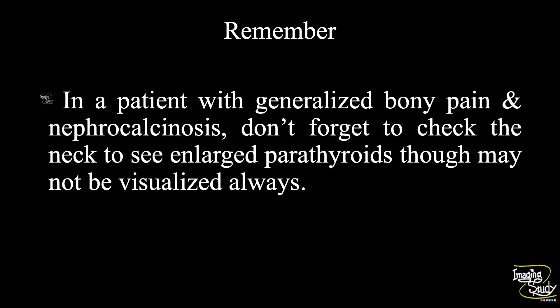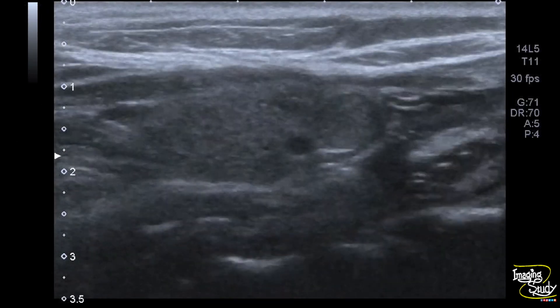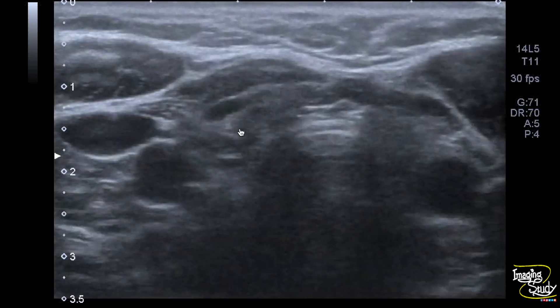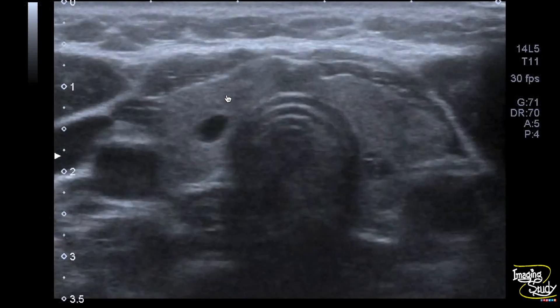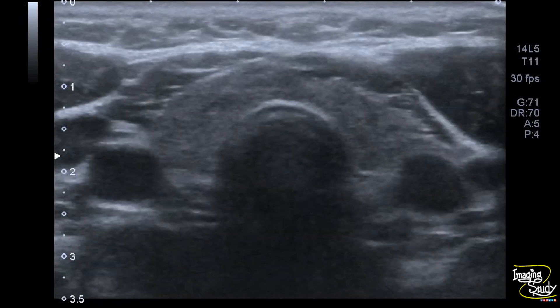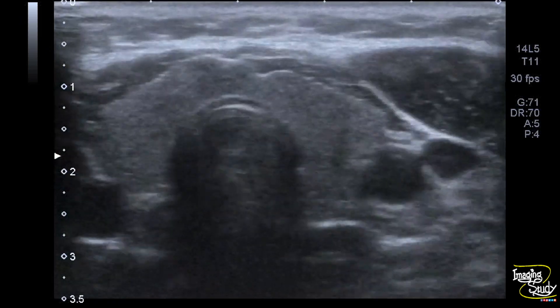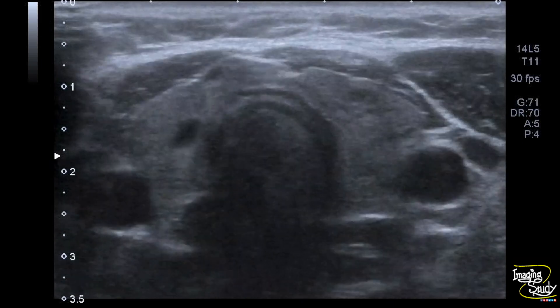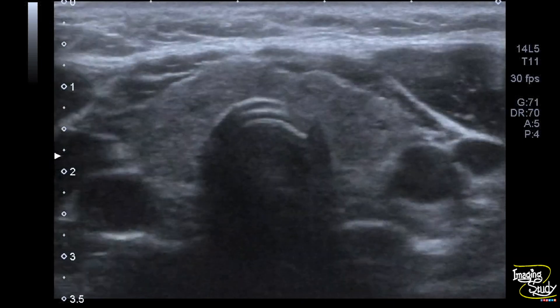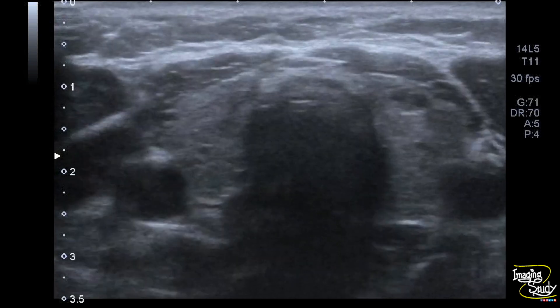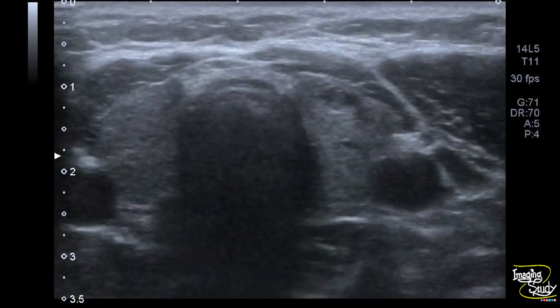You may ask about the situation of this patient's parathyroid gland. We have scanned the thyroid gland of this patient. There are multiple solid, cystic, and complex nodules within both thyroid lobes. However, no definite parathyroid enlargement could be visualized. So don't forget to check parathyroids in patients with medullary nephrocalcinosis, though it may have different causes also.